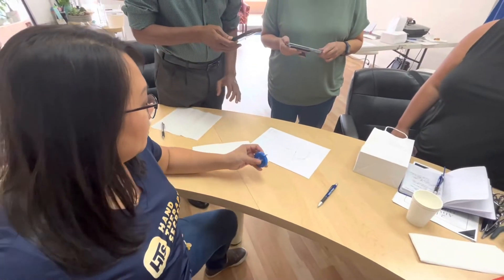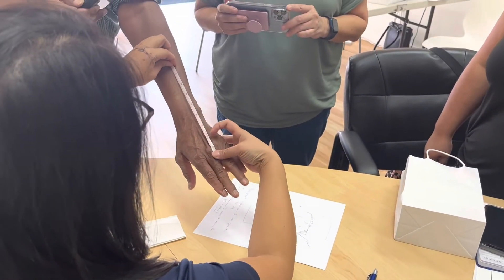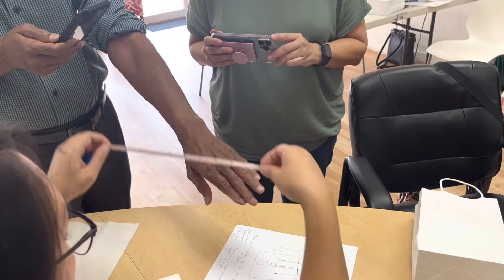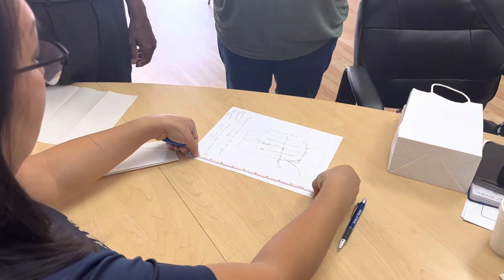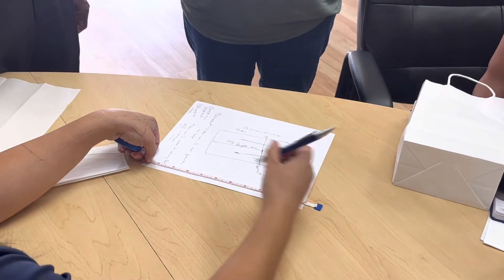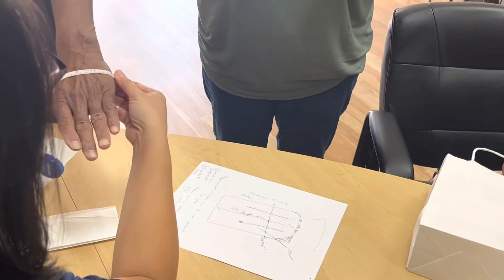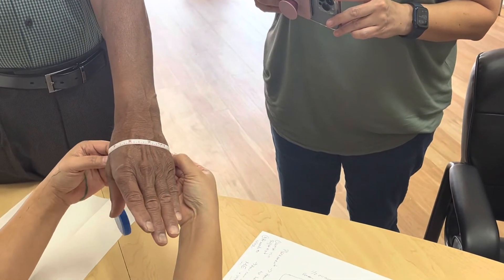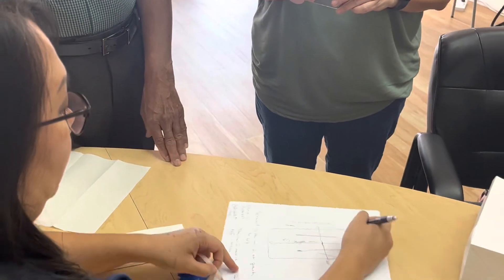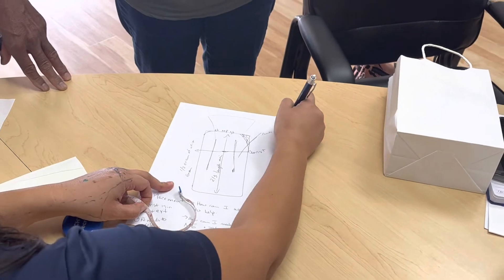If we are measuring, I can say: from the MP joint to two-thirds the length of the forearm is about 10 inches. I'll give myself a little extra room — 10 and a half inches — so I can trim. My width will come across the hand to include the thumb, so I'll be safe at five and a half inches.